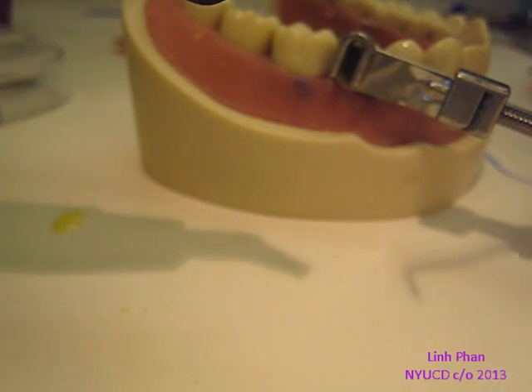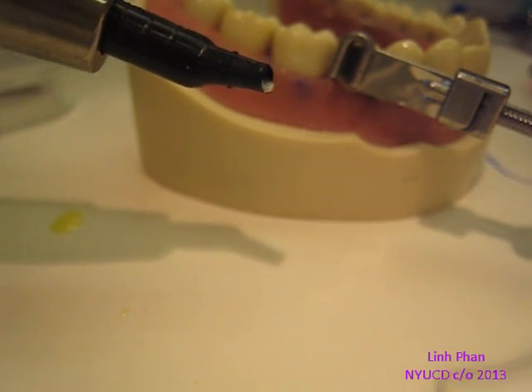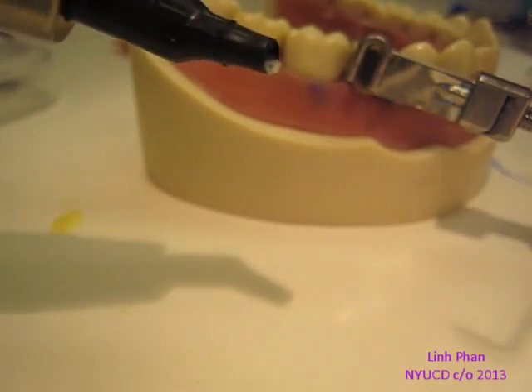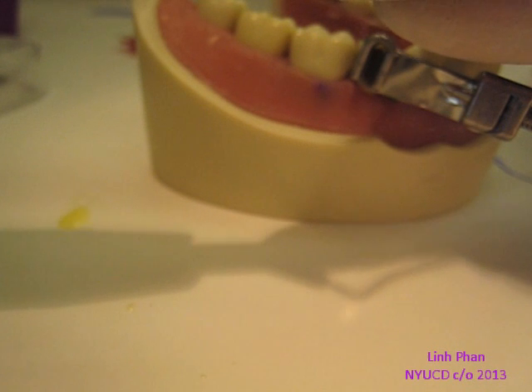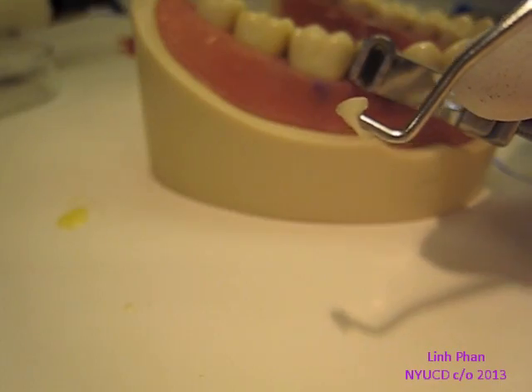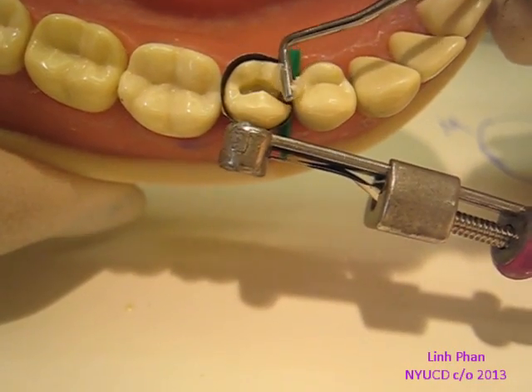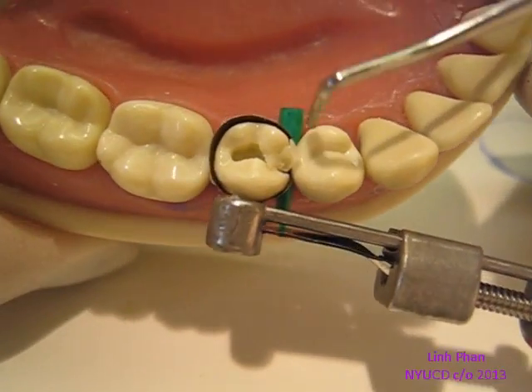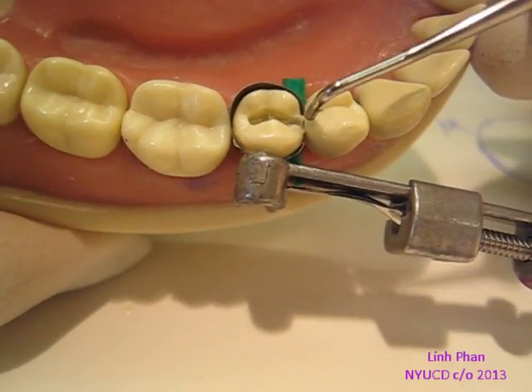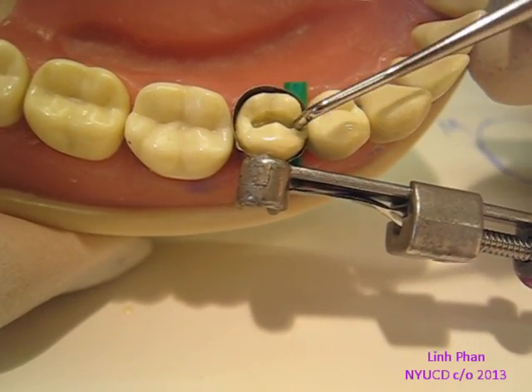So I take this instrument — the one that has the plugger side — and dip it in a little bit of bond. Just a little bit. You don't want too much because it'll mess with the composite. So you want to take a little bit, and I scoop out a little bit. I scoop out about a small amount, and then we're going to start with the proximal box. I'm going to go ahead and try to negotiate it in there. Sometimes it's hard because it's like a little booger — it doesn't want to come off.